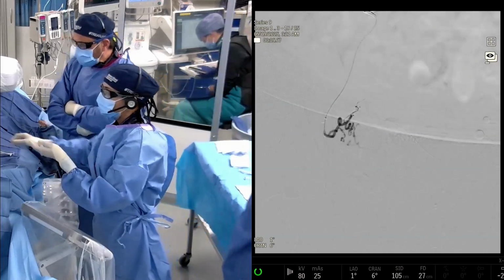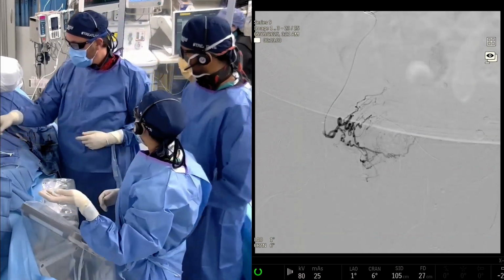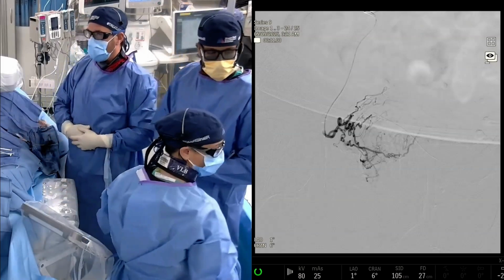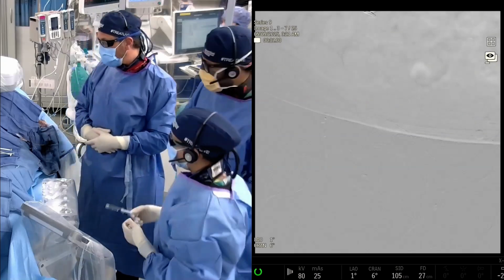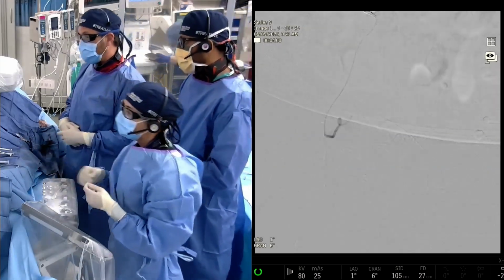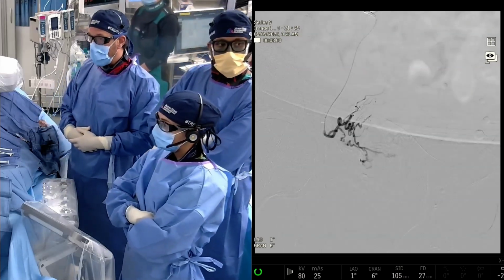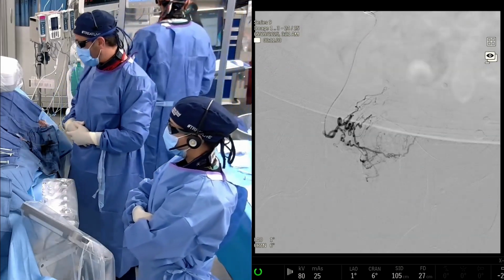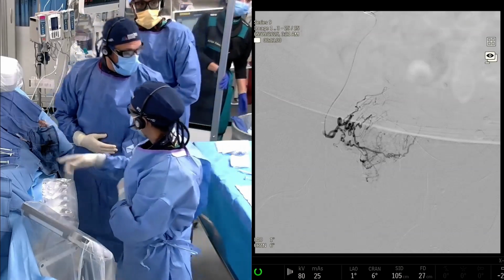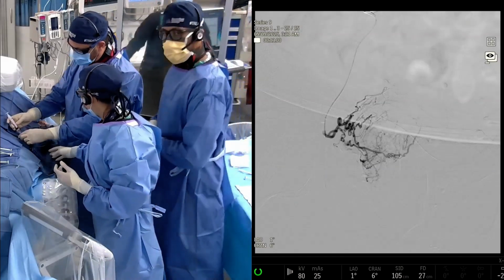So you guys make this look easy, but honestly, that distinction with the balloon up versus down is critical here, right? Like it completely changed the flow dynamics. I mean, that's one of the reasons why we like to use this. There's other reasons as well, but this is one of the major reasons, particularly when we see branches like that, so we have optionality to use the balloon or not use the balloon. But you're also going to see how deeply we can penetrate this embolic, which is going to be, I think, super helpful here.